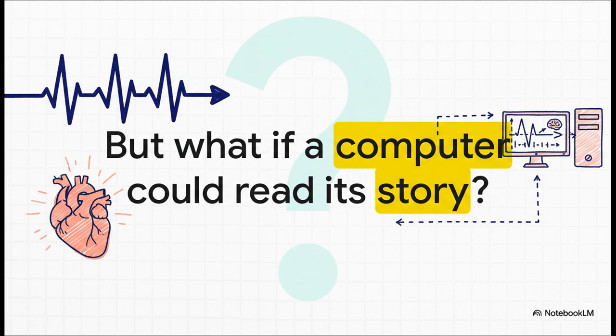It has a beginning, a middle, and an end, and it repeats over and over with every single beat. Every little up and down on that curve means something specific. And that's our mission today. We're going to teach a computer how to read that story.